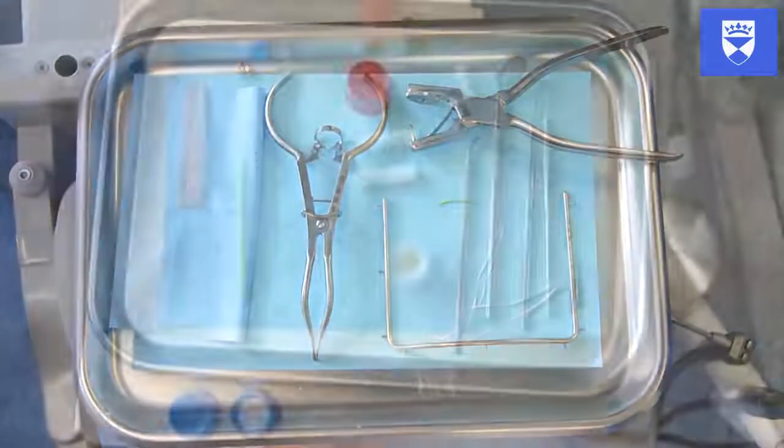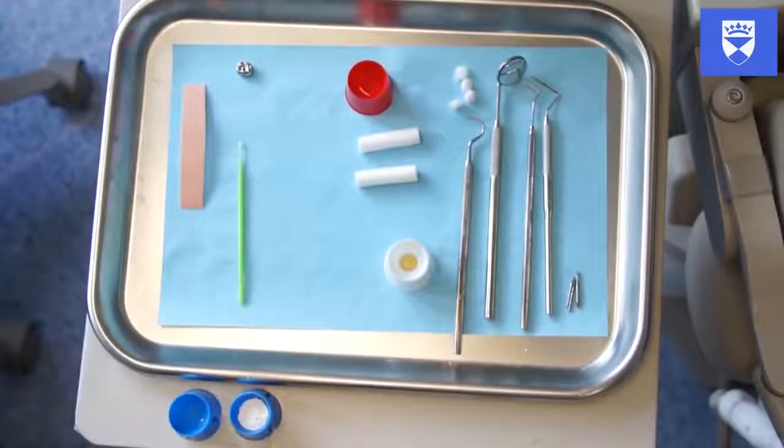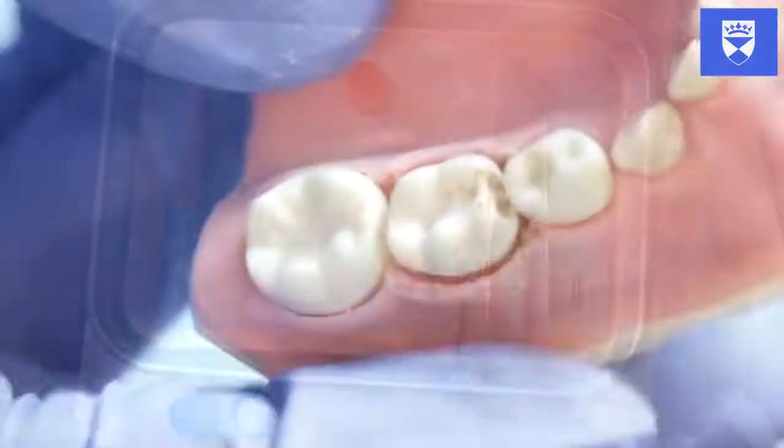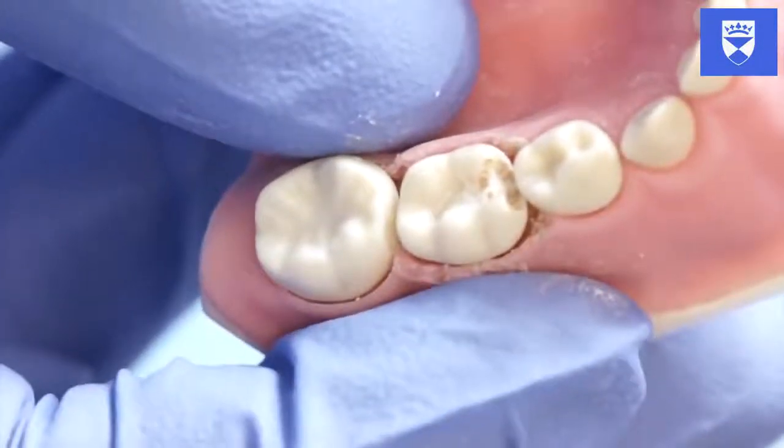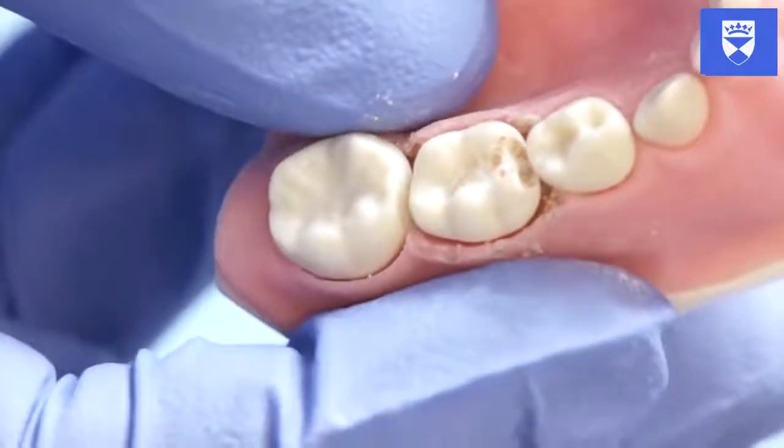Crown is also covered. On the screen, you can see a selection of materials and instruments that you may find useful in undertaking this procedure. It must be noted that clinically, when undertaking this procedure, local anesthetic is required. Rubber dam should be used when undertaking a pulpotomy. This will protect the airway, increase patient comfort, and reduce the chance of bacterial ingress.